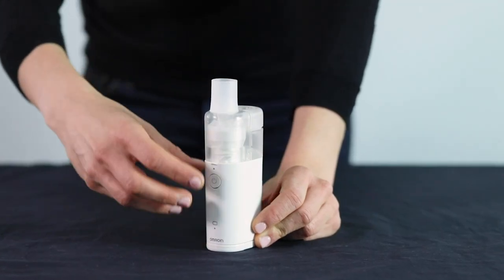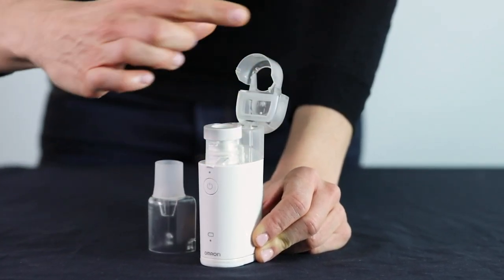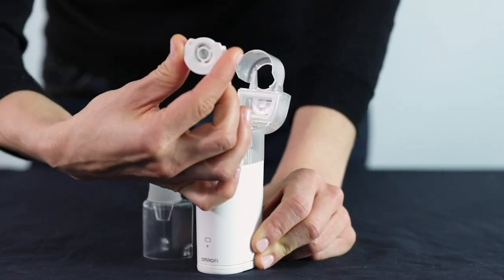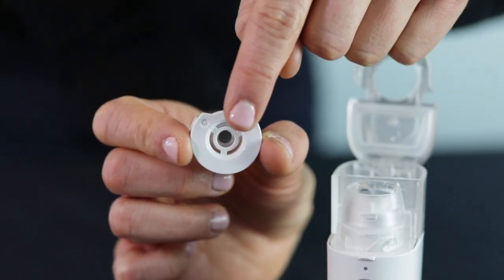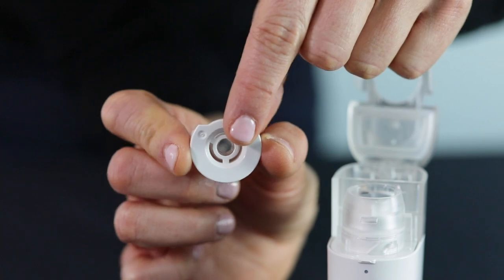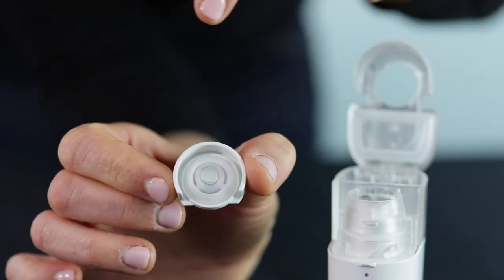Finally, the mesh cap. Because this is exposed, it is slightly more fragile than the other units. You really want to be especially careful not to squeeze this part too hard or stick your finger in the middle of it. As with its predecessor, this is the part that should be replaced every year as indicated in the manual.